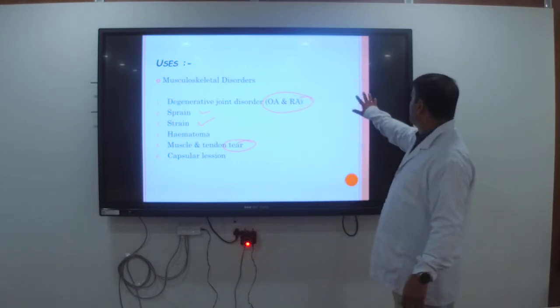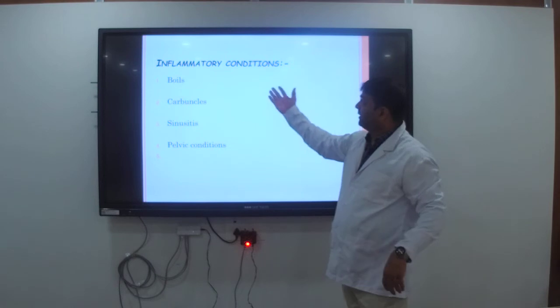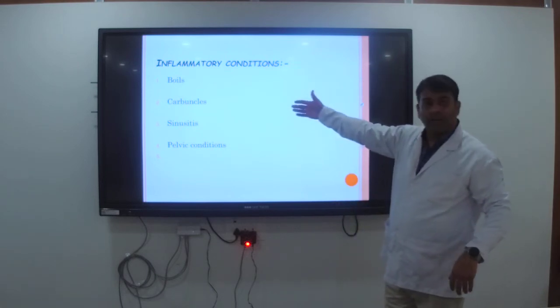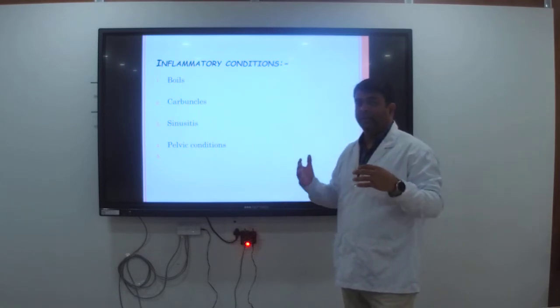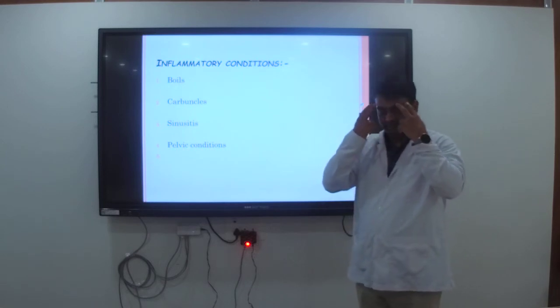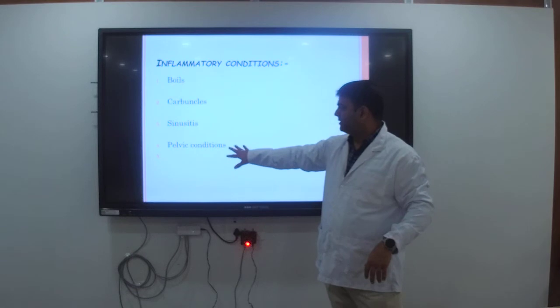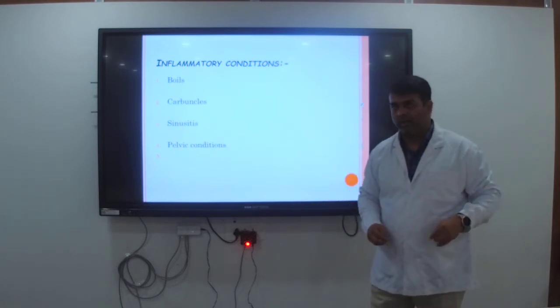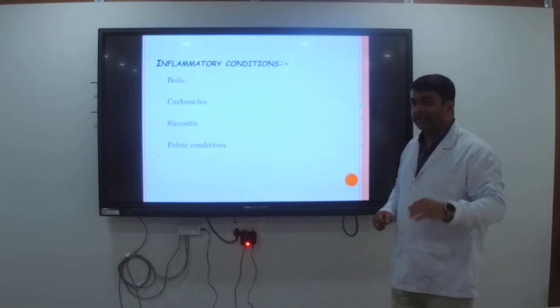Now, what are the inflammatory conditions where you can treat with SWD? Boils, carbuncles. As I said, the crossfire method is the method where you can treat sinusitis over your face, and then the pelvic conditions, your sacral pain, or maybe something else.